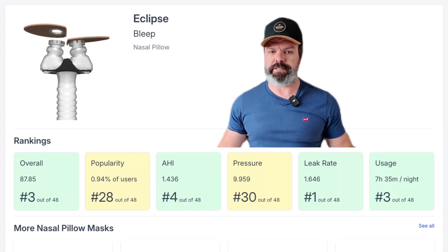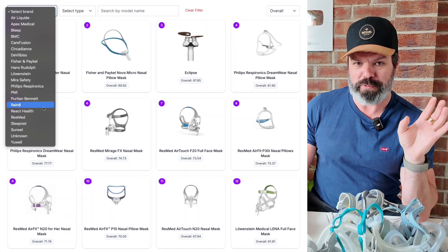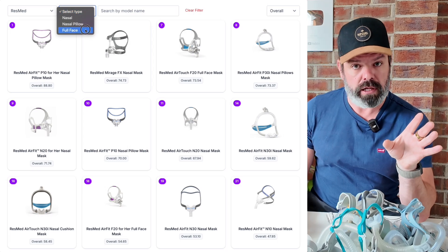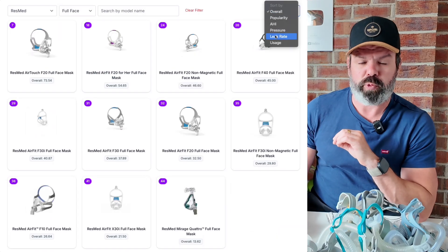Well, Sleep HQ Pro members have just unlocked a world's first — you won't find this on any other platform — live CPAP mask analytics. Real world mask performance across thousands of members, millions of nights, sorted by brand, type, and performance. If you want to know which ResMed full face mask has the lowest leak, we can tell you. Or which nasal pillow mask is the most popular fan favorite — we have this information available.